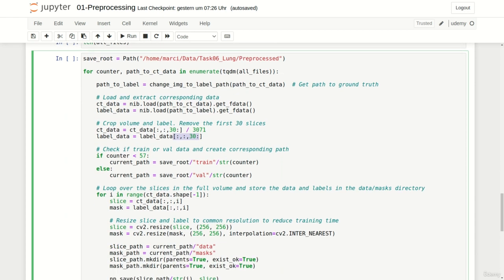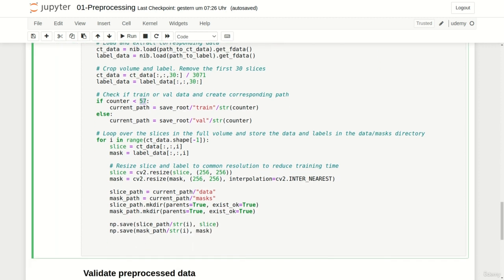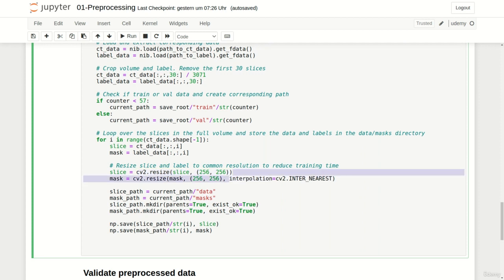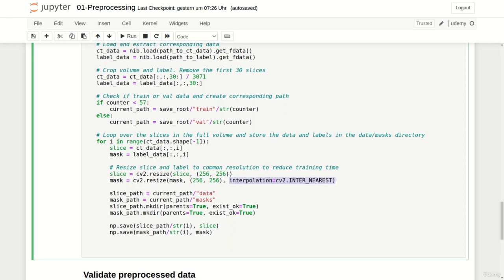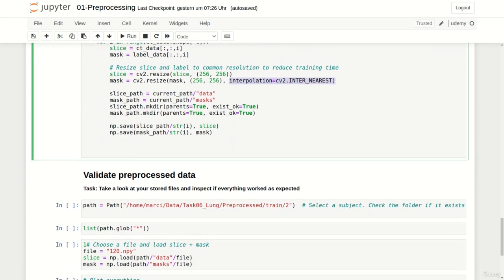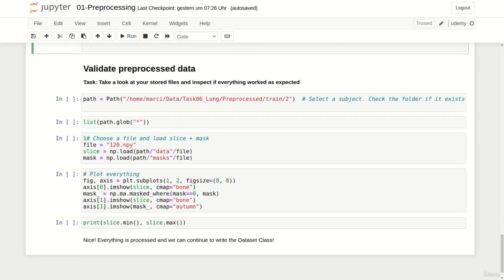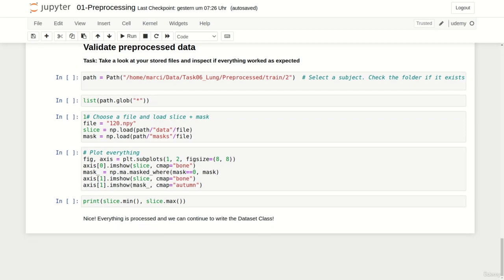Regarding the train test split I used 75 train patients and the remaining ones for validation. Before saving the individual slices and the segmentation masks I resized them to 256 squared to drastically reduce the training time. When resizing the masks I used nearest neighbor interpolation to ensure that all pixels are either 0 or 1. The validation part remains unchanged besides swapping the path and the file we want to plot.